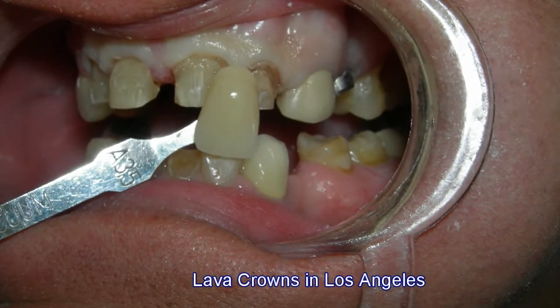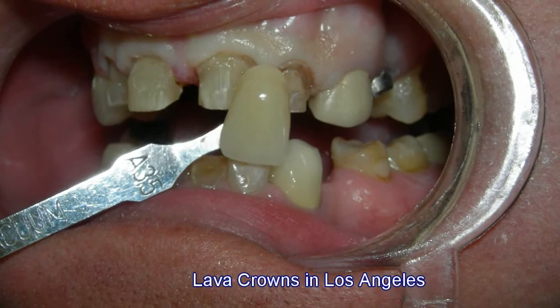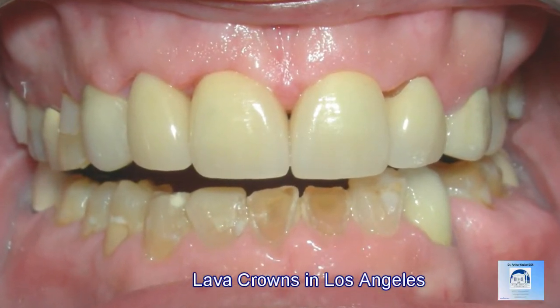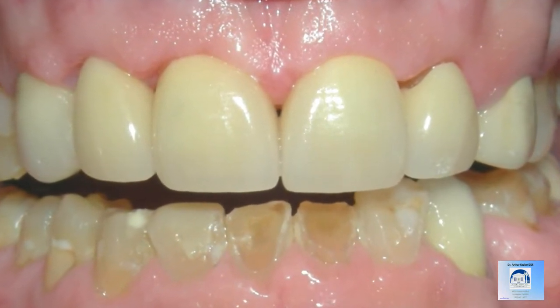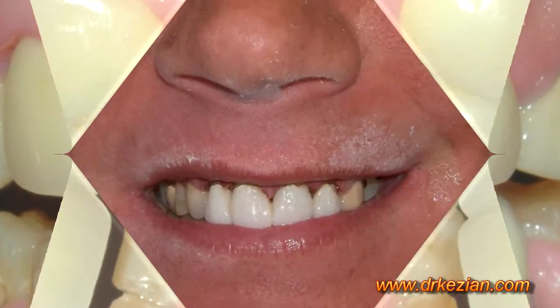Here you see a comparison of the color of the crown to the color of an existing tooth in the mouth, and you can see it matches very well. And with all the lava crowns now placed into the tooth, you can see a nice straight smile with a very realistic look and a very harmonious balance within the mouth.